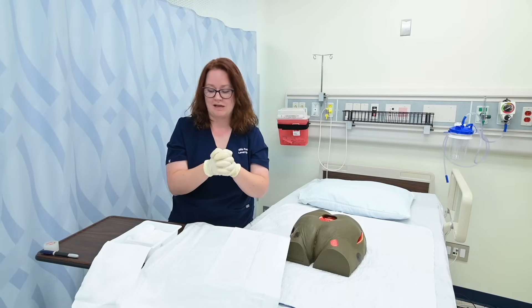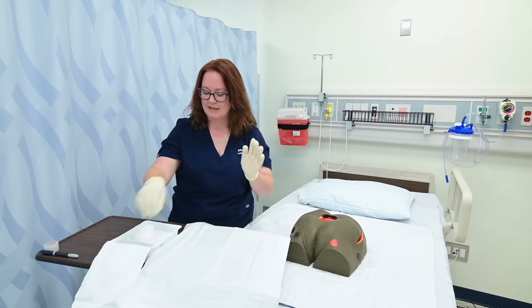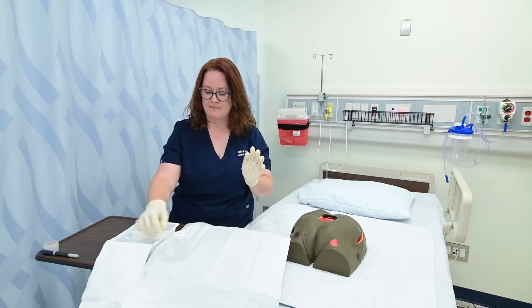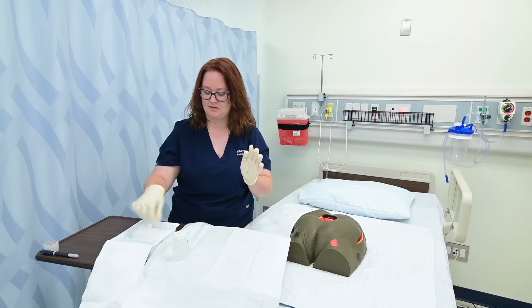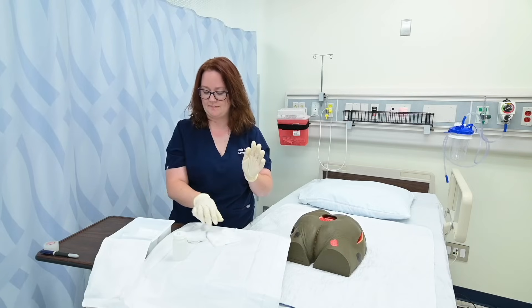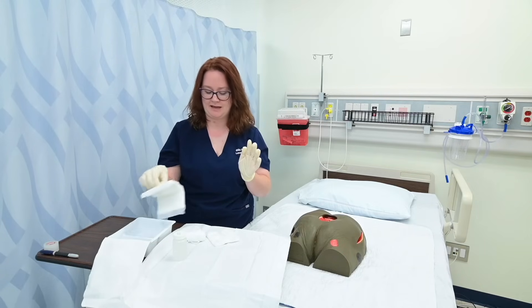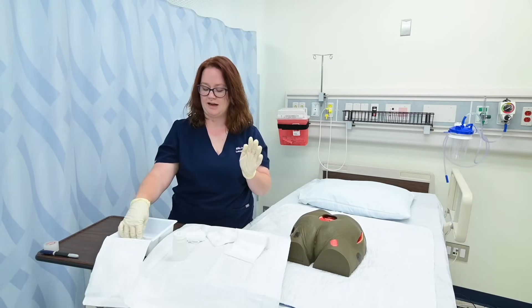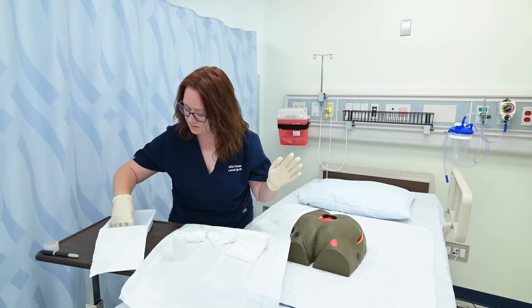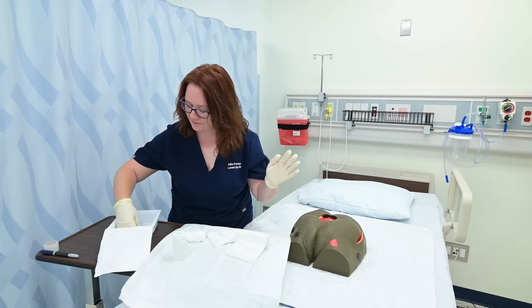I'm going to go ahead and grab the items out of the sterile kit. In my kit, I've got saline, some tape, a roll of cling, sterile gauze, an ABD pad, and then I actually have a label to label the dressing itself when I'm done.